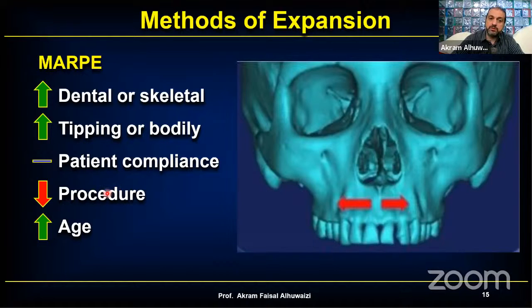And the procedure, well, the procedure is also quite difficult. You'll still have to band it and then do wire bending, send it to the lab, re-cement it, educate the patient, follow the patient up. So the procedure is a little bit more difficult, but it's much easier than doing it surgically.